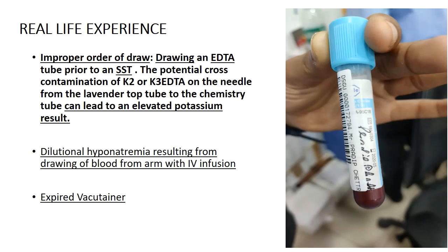What happens if you draw EDTA prior to biochemistry SST? The potential cross contamination of K2 or K3 EDTA on the needle from the lavender top tube to the chemistry tube can lead to a falsely elevated potassium result.